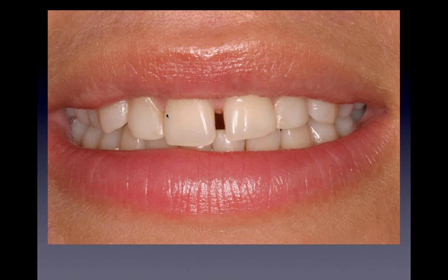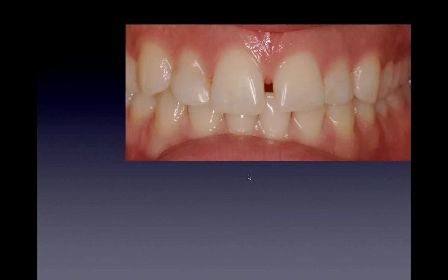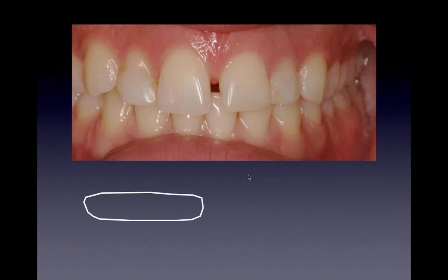So I take this patient and do a full wax-up. The patient pays a little bit for that, so I get a full contour wax-up. We take the wax-up, duplicate it into a stone model, and then we use that as a matrix. So it's a wax-up, a stone model, then a suck-down with the OmniVac to get a nice perfect position. But the key to this case is the enamel rods and the preparation. So here's the preparation.